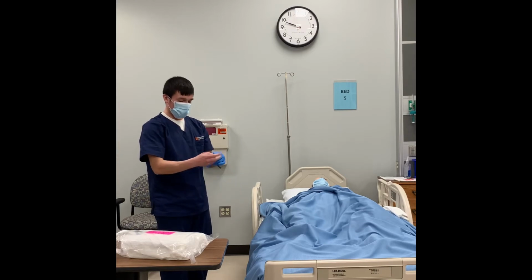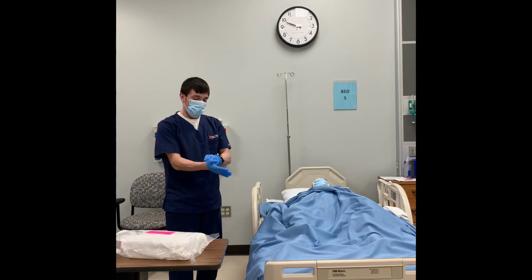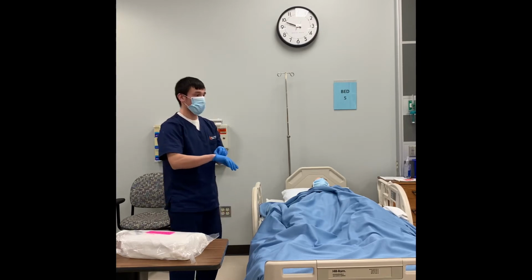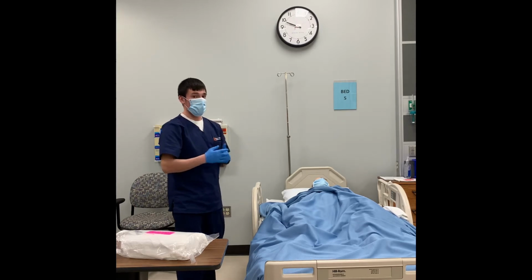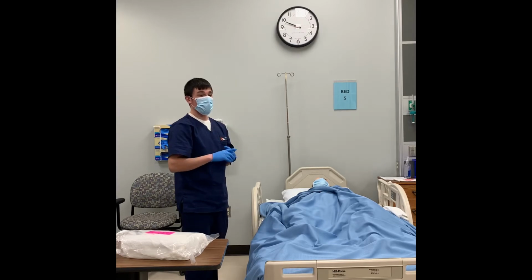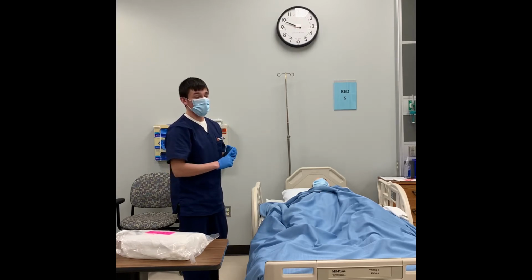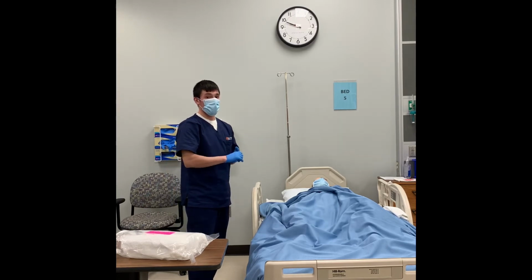And then I would inform the patient of the procedure that we're going to do today, see if they have any questions, and make sure that it's okay that we perform this procedure. Ease their mind by answering any questions as well. Before we would start, there's a couple things that we would do. The first one is perineal care or perineal clean. And before we would do that, we would want to lift the bed up to promote proper body mechanics.